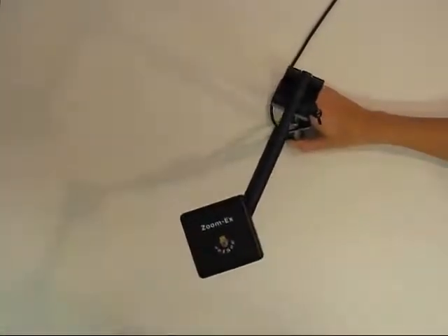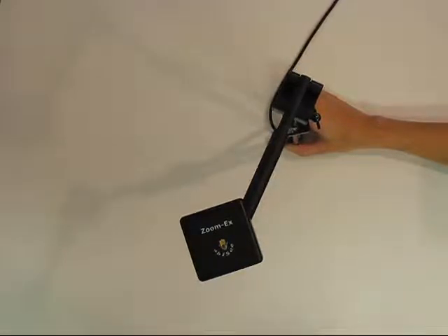Step 1. Gently fold up the ZoomX head into a right angle position. You will hear a light clicking sound. This sound is an indicator that the head is in a secured position.